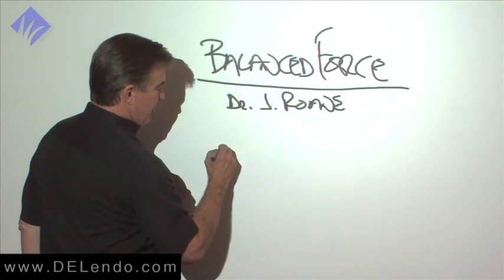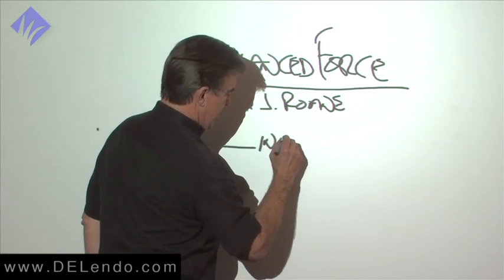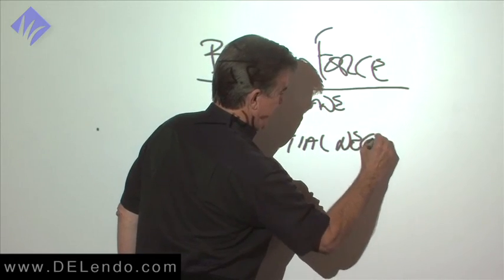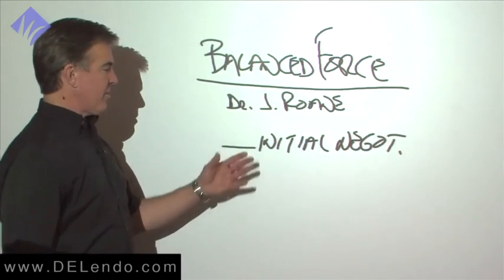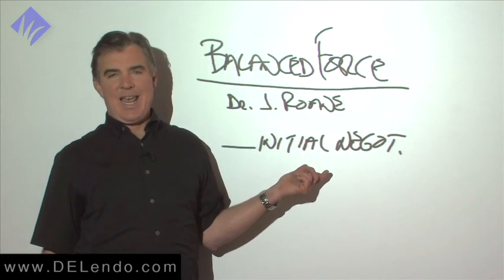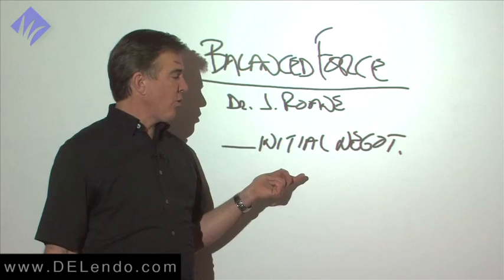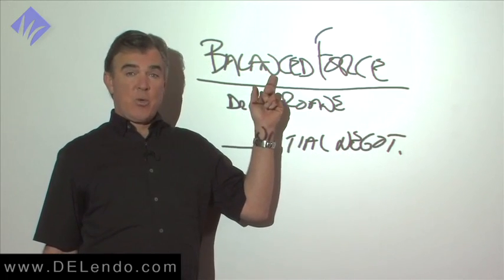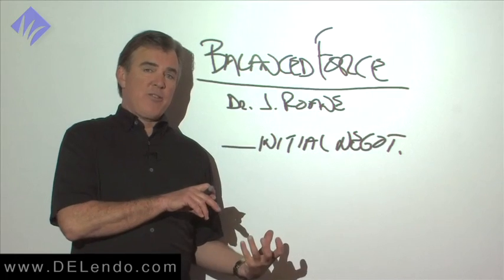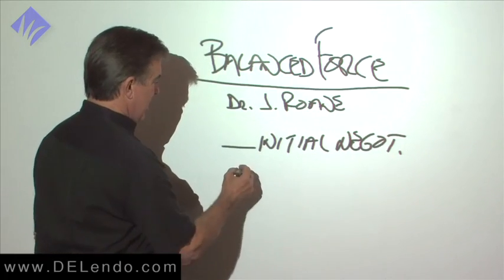I use the balanced force for initial negotiation. I can talk about it on a different topic, but suffice to say, if I'm having trouble getting an 8 or a 10K file to lengthen a small curved canal like an MB2 of an upper molar, all I have to do is use a 15 or a 20 with the balanced force technique, 3 or 4 millimeters away from those other files, and these files that were hanging up in the canal now passively drop to length.